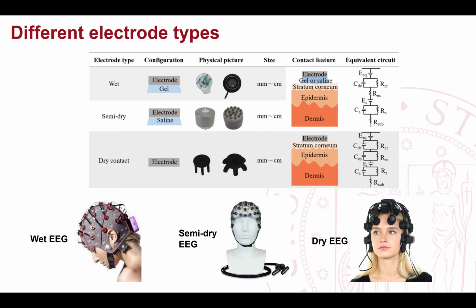Because with the gel, you don't have any problem. You just have to put more gel. With the water, it could be problematic. Exactly. The problem we had was that the child's hair was so curly. Maybe for him, it would be better to go with a wet. But there's no other solution for that. You consider that this is an unsolved problem.